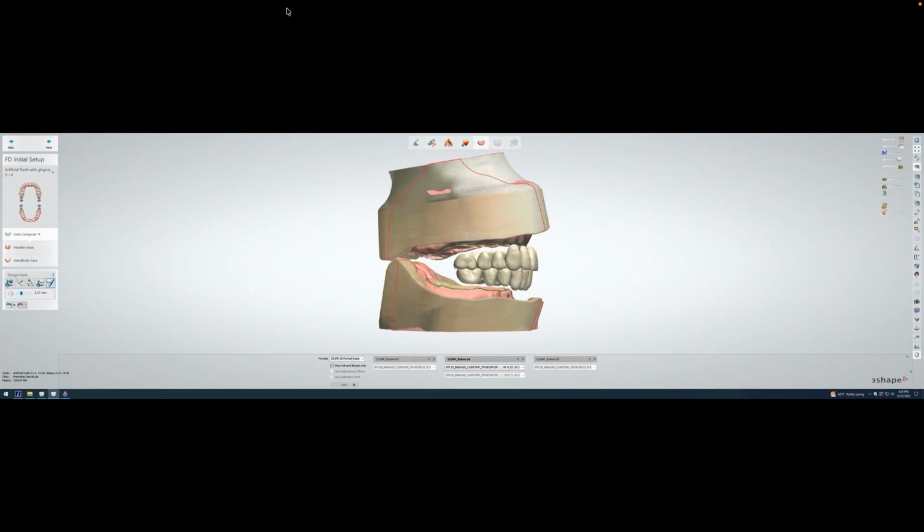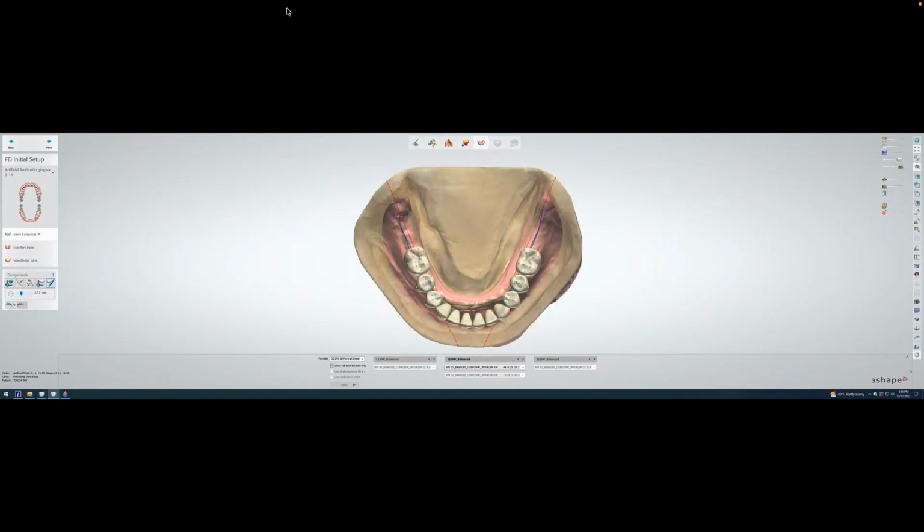You see the occlusal plane, half to 2/3 the height of the retromolar pad, where the upper and lower anteriors are set up. You see the Pound's triangle, everything that we talked about. You see how seamlessly they come together in the digital workflow, and you can actually check it right on the monitor.